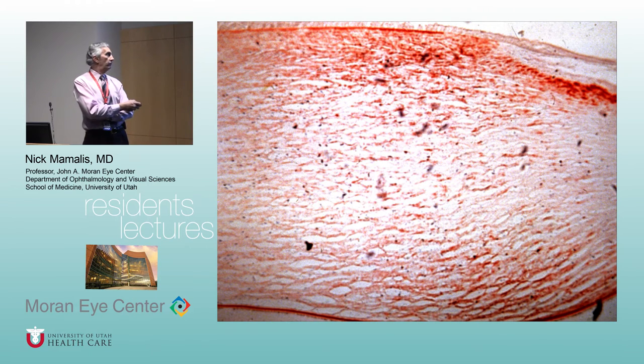And so this is a stain on actually a fresh cornea, and I had a copy of this from Dave Apple. I mean, you know, we don't get fresh corneas sent to us. And so this is an arcus senilis, and you see that the deposition of lipid is more anterior and more posterior, and people say it's shaped like an hourglass. You know how an hourglass comes into the middle and then goes out above and below? So it's shaped like an hourglass here and then here. So the lipid is more posterior and anterior. And again, it diffuses in a little bit from the limbus.